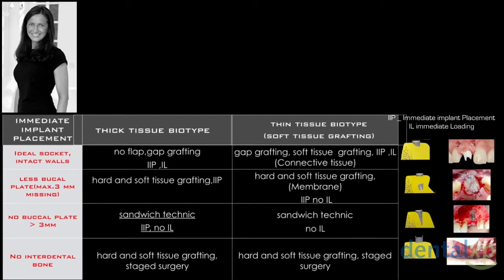Okay, when we have a buccal defect, coronally or apically, what do we do here? Can we do an immediate placement? Now I'm swimming against Dr. Lee's wave, right? Yes, we can. What do we do here? A grafting and a membrane or a connective tissue? What do we do over the grafting? A membrane? Yes? A connective tissue will be part of the graft, so it's not appropriate. A membrane and a flap.